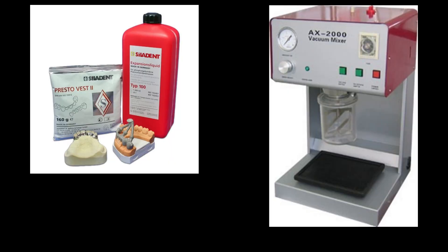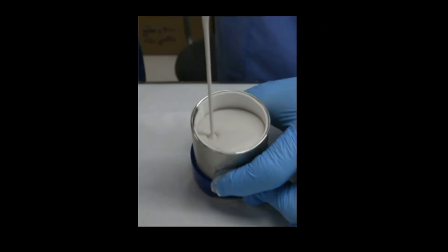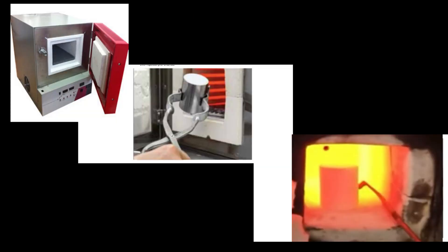Next, we mix the investment — the investment powder and the liquid as shown on the left. If the material is a metal ceramic, the investment of choice is phosphate bonded investment, and we use a vacuum mixer to do this. Then we fill the mold completely. Once it's set, it is kept in the burnout furnace. The temperature setting varies based on whether it is a gypsum or a phosphate bonded investment.